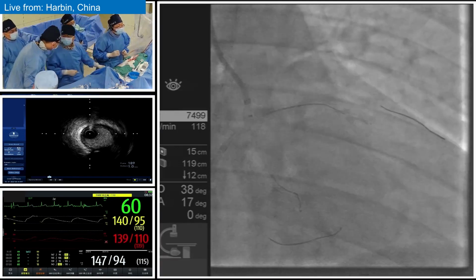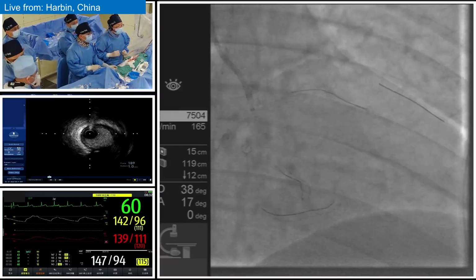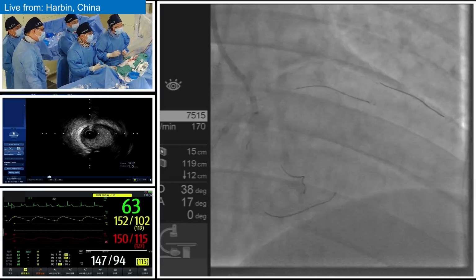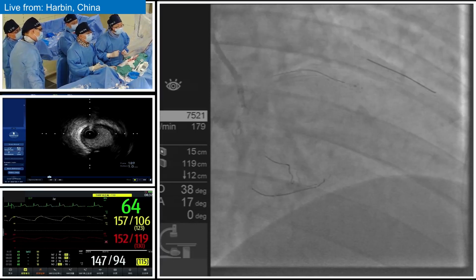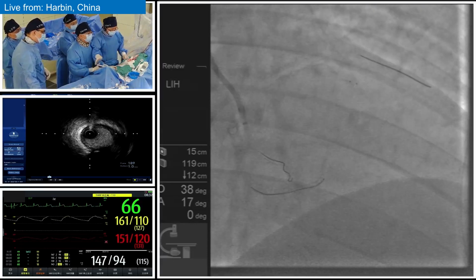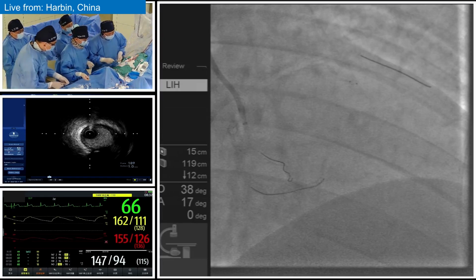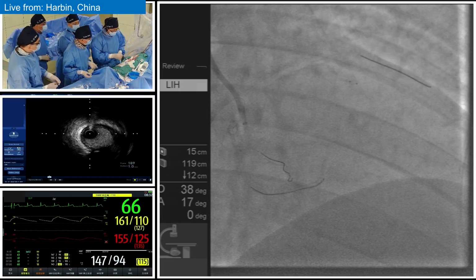Second, it can reduce the likelihood of deflection outside the vessel architecture or into a side branch raising into the occlusion. This is of key importance, especially in ADR techniques like the stick and swap strategy.